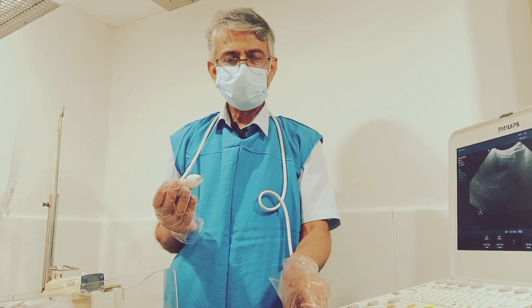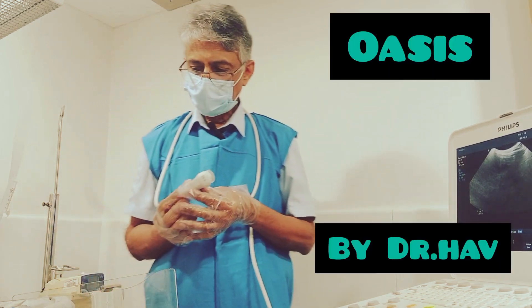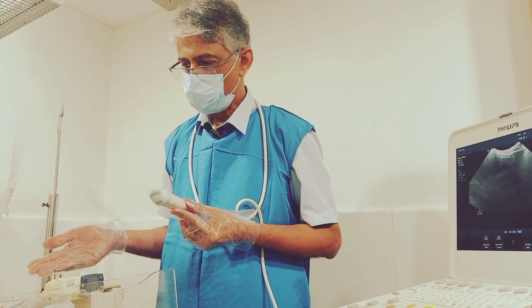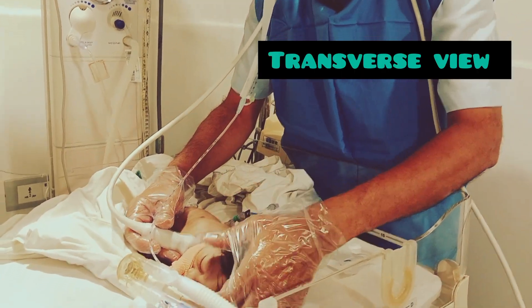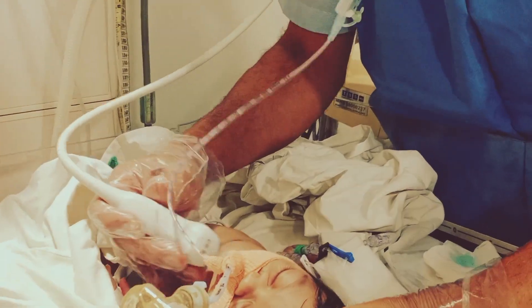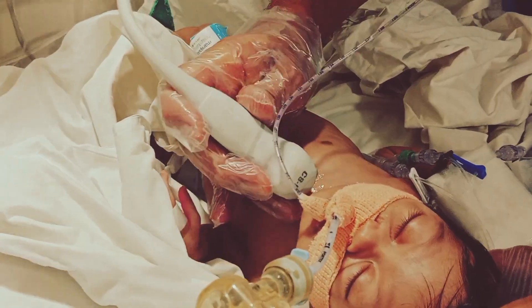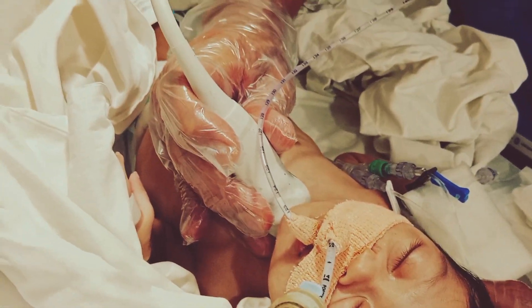Welcome to Objective Assessment of Sickness in Neonates Using Sonography. As you can see, this baby is intubated. You should keep the probe transversely in the neck, just above the suprasternal notch, where you can see the structures.